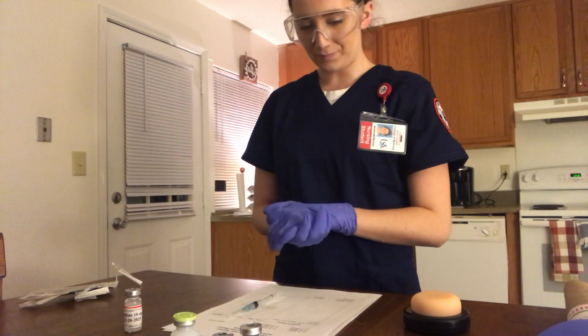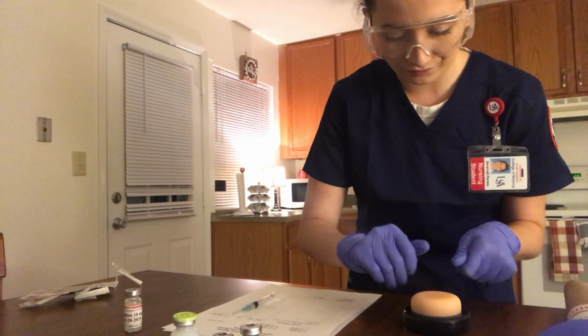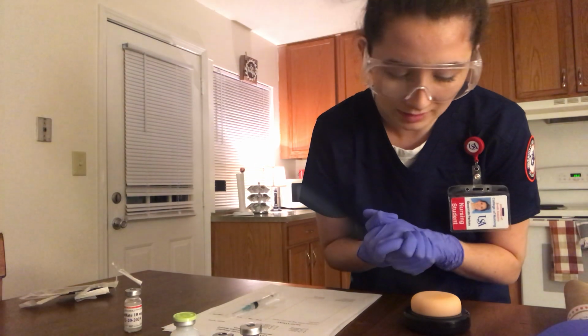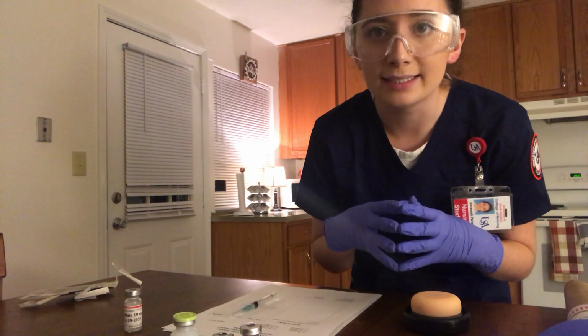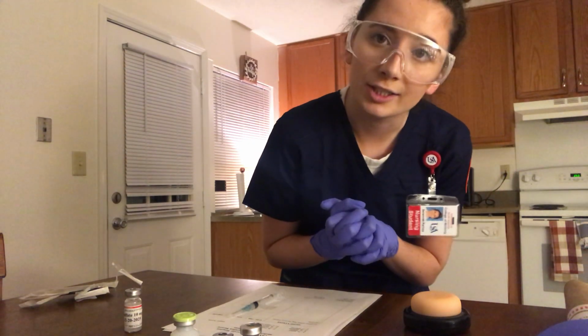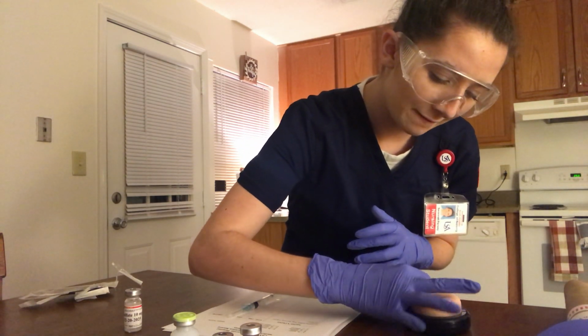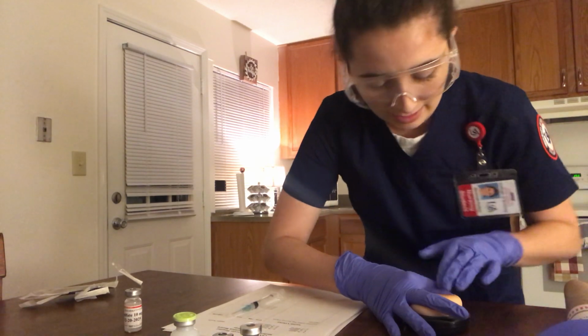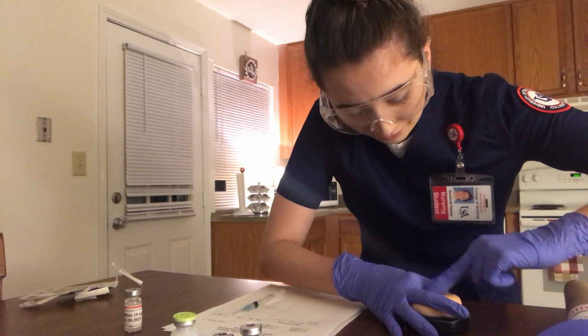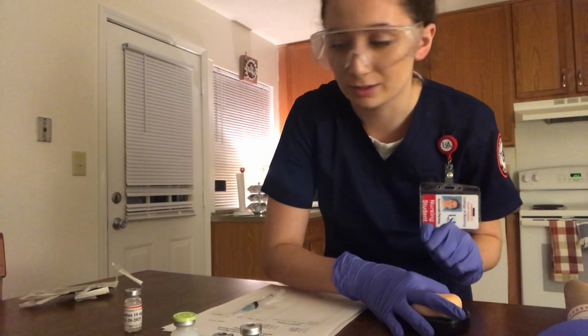After doing that, I will position my patient and expose only the injection site. This injection site is the ventral gluteal. I would locate this using the greater trochanter on the patient and the anterior iliac crest. I would form my hand in a V shape, and I would assess the skin, looking for any bruising, and identify that it is good muscle.